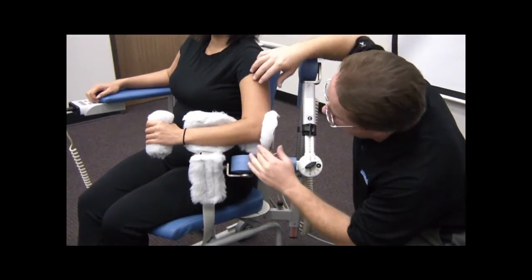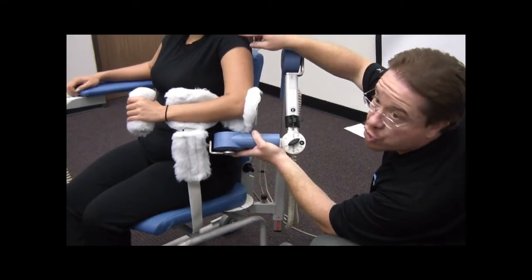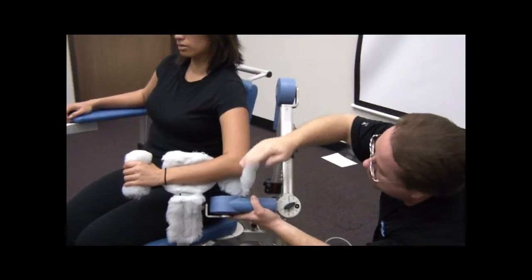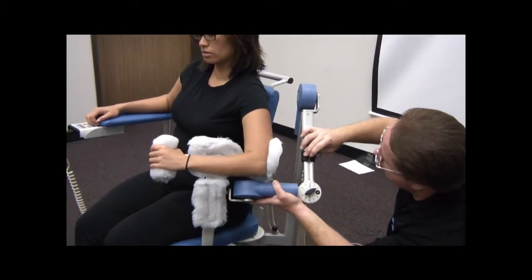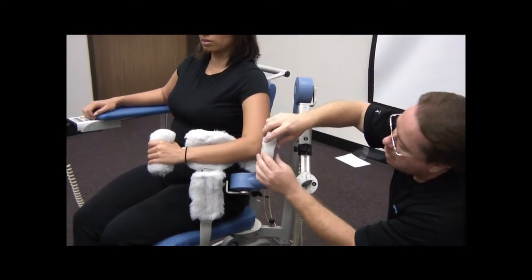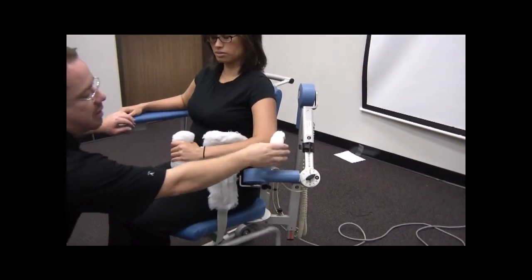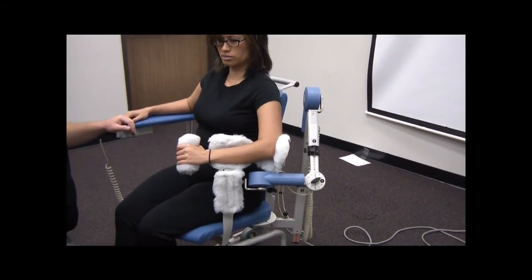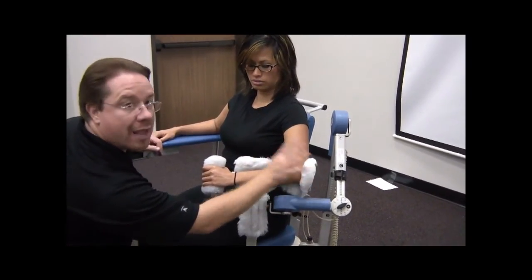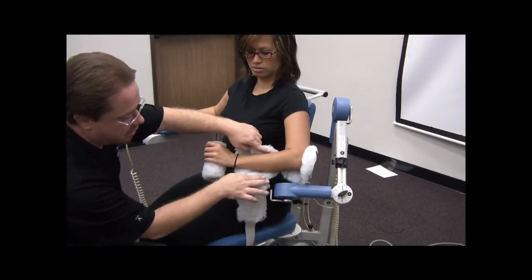Now, what we want here on this length, I don't want to jam her shoulder up like that. I don't want her to have to droop down to get her arm in here. We want it to be a natural position. So I think right about there is going to be good. This back piece, and I always explain to the patient that this back piece here is just a backstop, if you will. It keeps the arm from going backward. Her elbow will move in here, and that is okay. The important part is that we keep her in this orthosis here, into this cuff here.